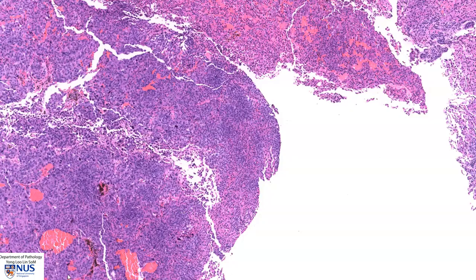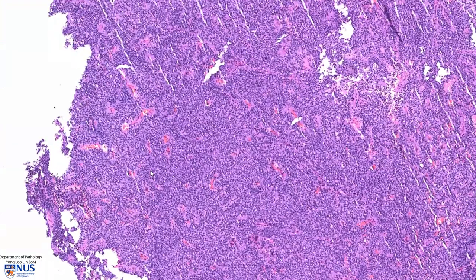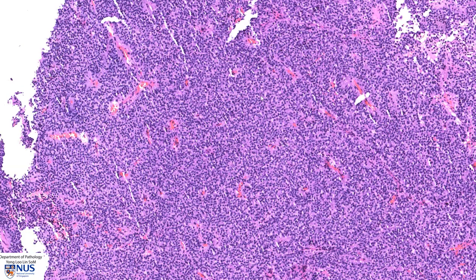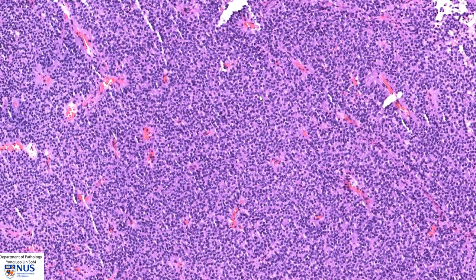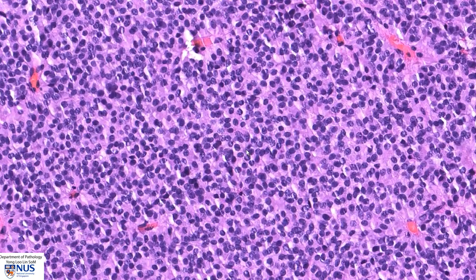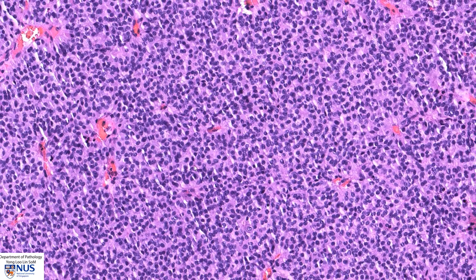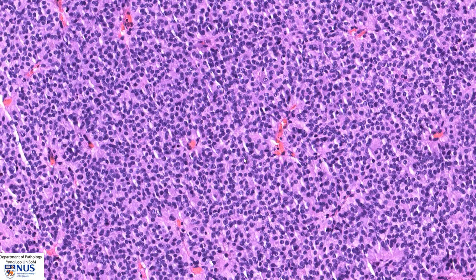Here is another example of a pituitary neuroendocrine tumor, and you can see that this tumor has a more sheet-like architecture. Again, the cells have a very monotonous look with round nuclei and moderately abundant cytoplasm. Again, we are able to see many small vessels coursing through the lesional tissue.